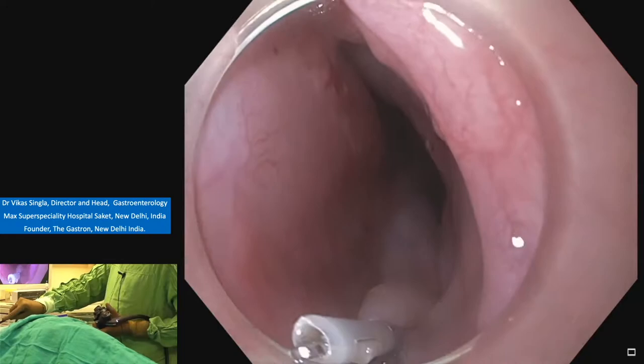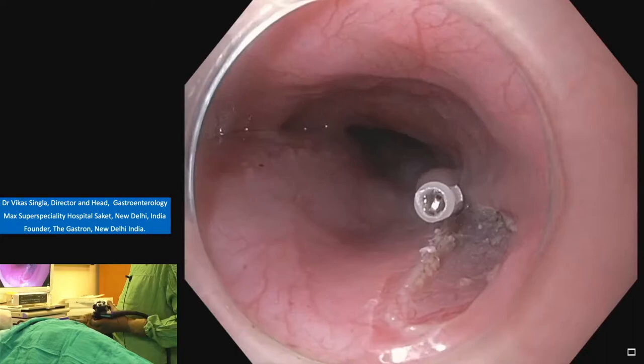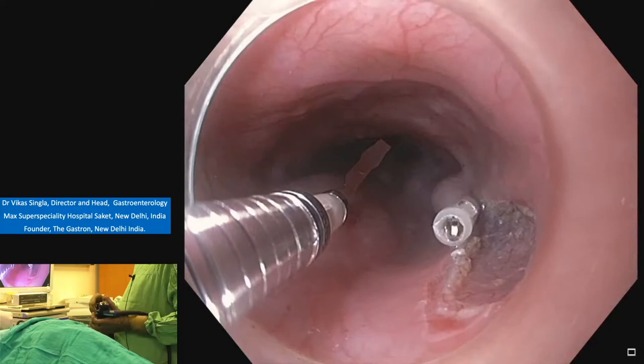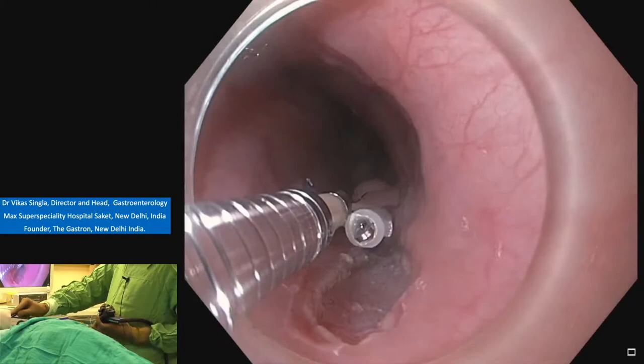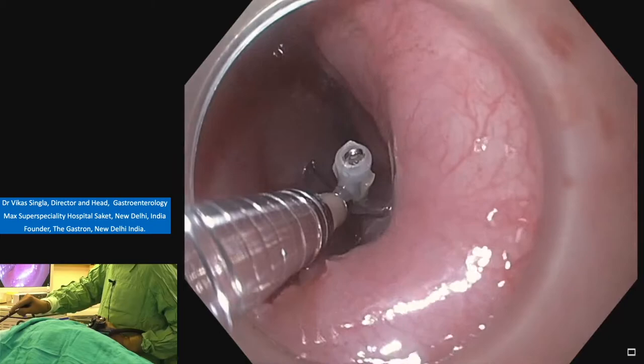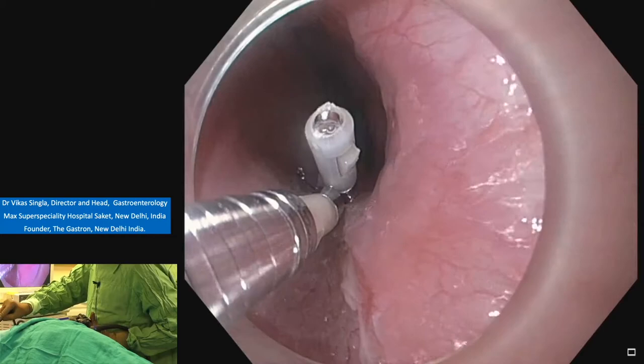The first clip is distal to the incision. Hold it. Open. Rotate. Wait. Down, fire.